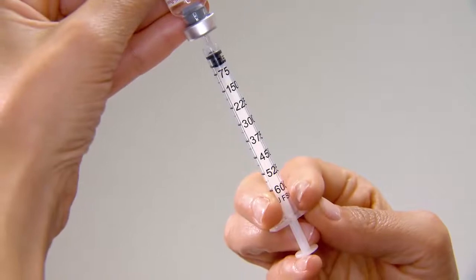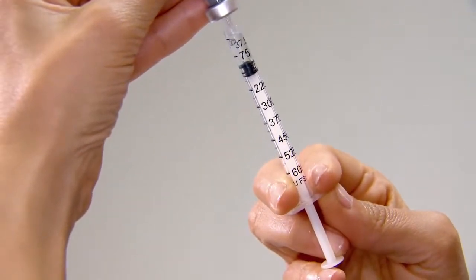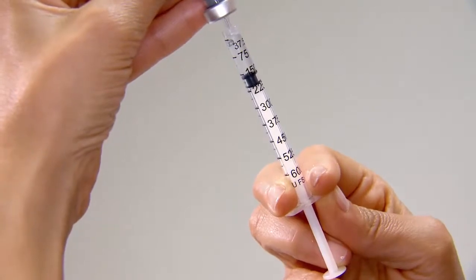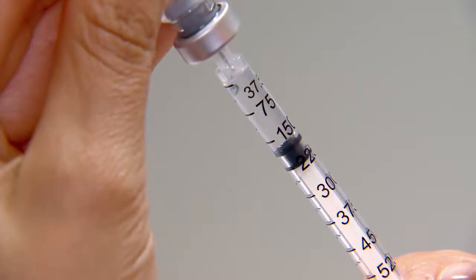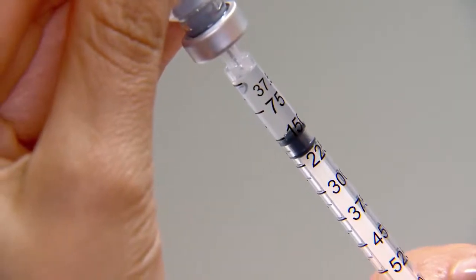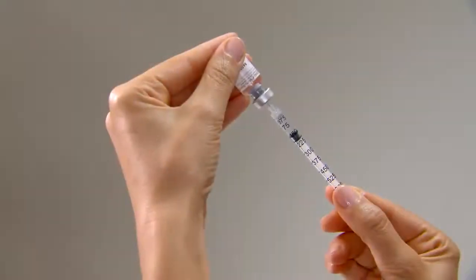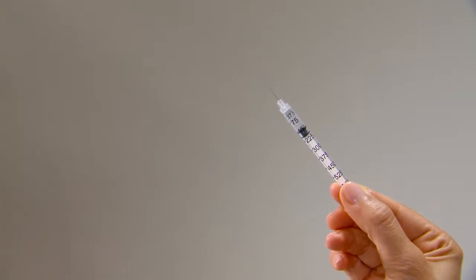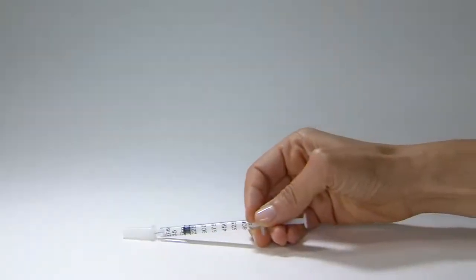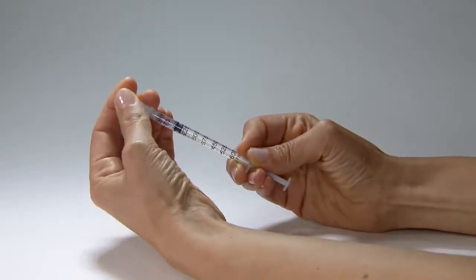With the needle tip in the liquid, slowly pull back on the plunger until the syringe fills slightly more than the unit marking that corresponds to your prescribed dose. Keeping the needle in the vial, slowly push the plunger back to your prescribed dose. This will clear away any air bubbles. After checking that you have the plunger set at your prescribed dose, carefully remove the syringe from the vial and recap the needle. The custom dosing syringe is now ready for administration.